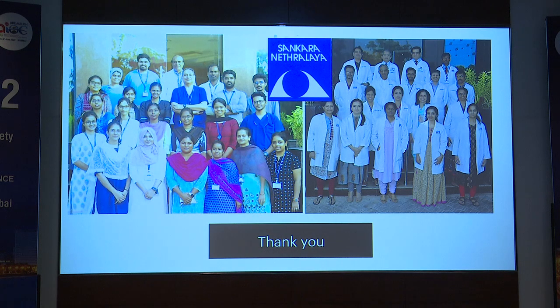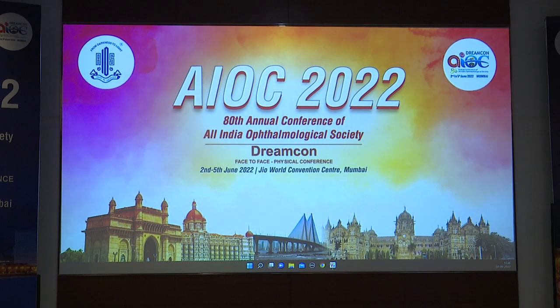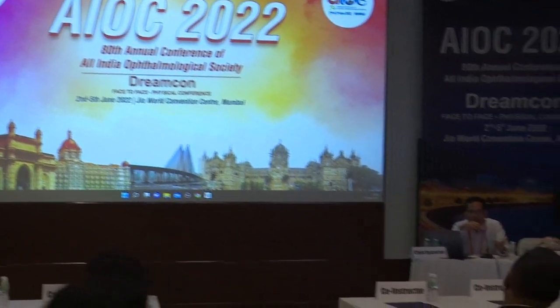Thank you, sir, for a wonderful presentation, as always. And I think that is what is important. You cannot absolutely depend on OCTA to make a diagnosis. It can be the third investigation, I would say. You do an OCT, you do an FFA or ICG, whatever you want. And then if you're still confused, you do that.